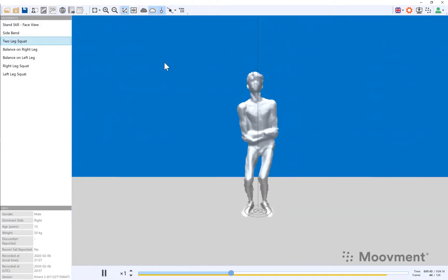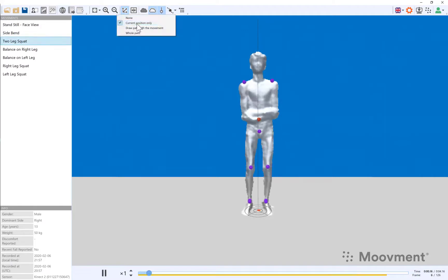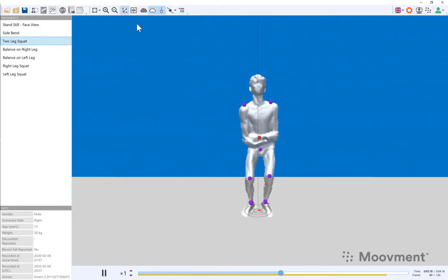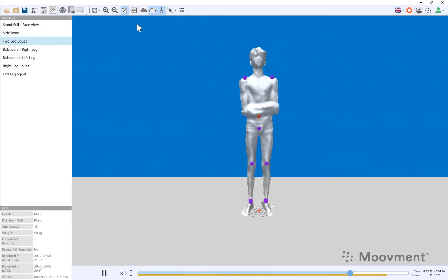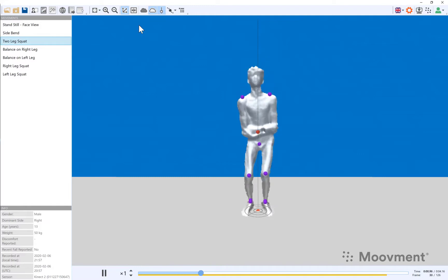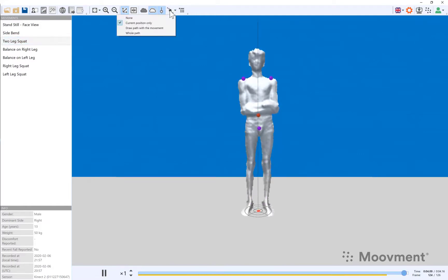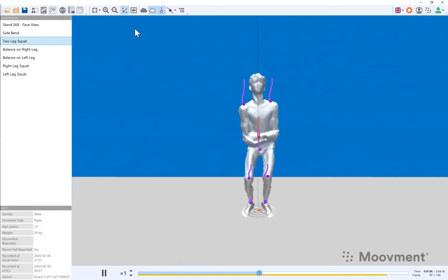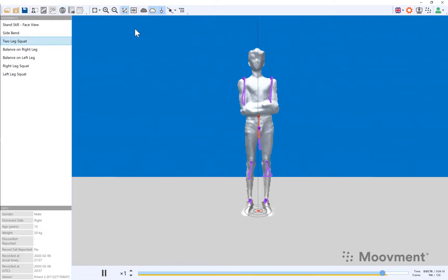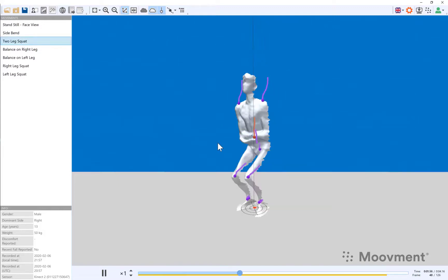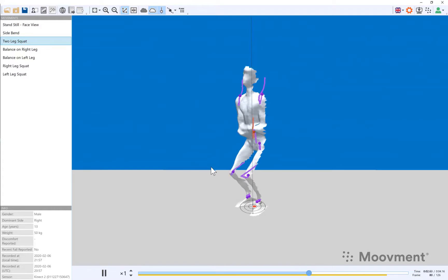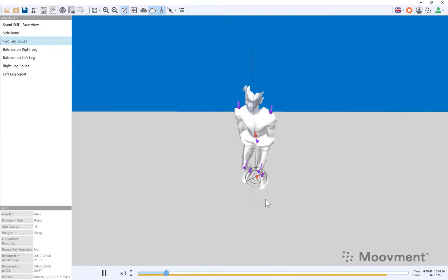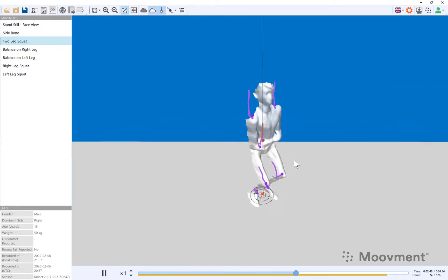The first layer we can add on top of his 3D image is his tracking points. These are what we call key points to allow us to build a biomechanical model, and then on top of that we can add the trajectories or the pathways that the body parts are moving, and of course you can see those pathways in 3D.